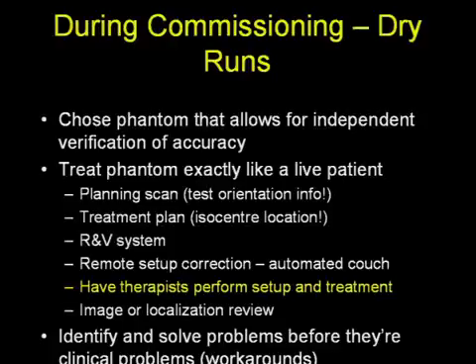And then the final bit is to take these images and review after registration with the reference data set obtained from the planning scan. So the beauty of performing dry runs is that as a group, you all identify and resolve the problems that the new user may face when implementing image guidance the first time around, and define what would be the clinical workarounds.